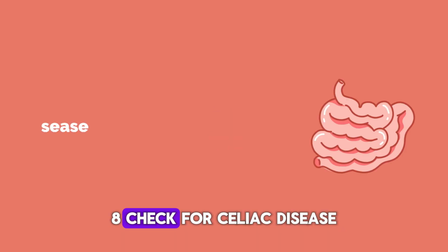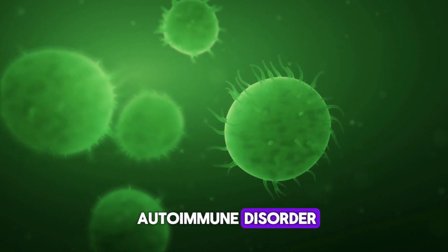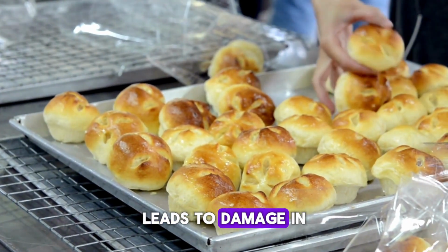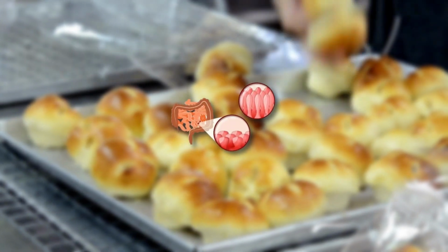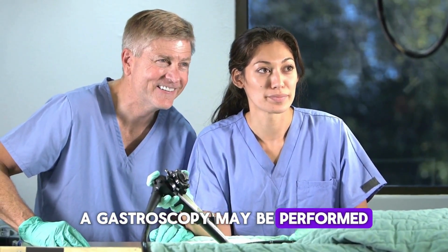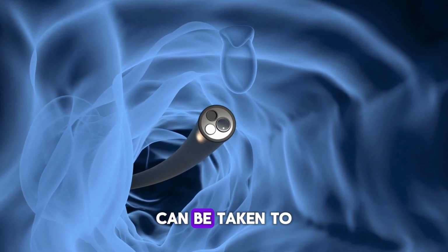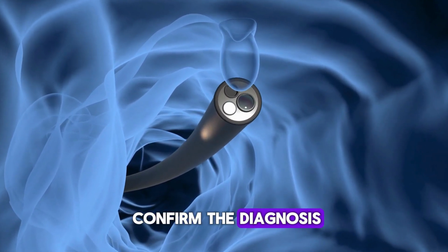8. Check for celiac disease. Celiac disease is an autoimmune disorder where the ingestion of gluten leads to damage in the small intestine. If celiac disease is suspected, a gastroscopy may be performed. During the procedure, samples of small intestine tissue can be taken to confirm the diagnosis.